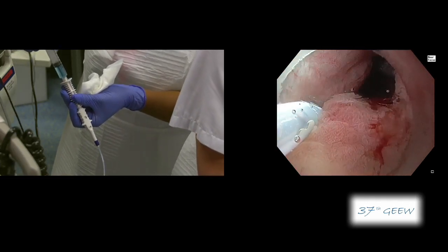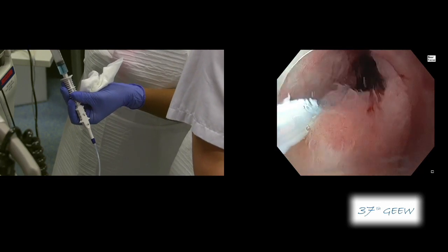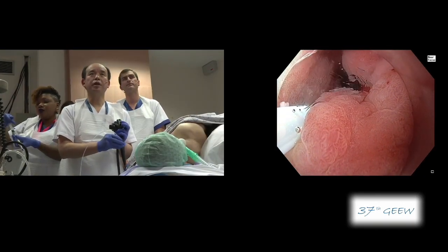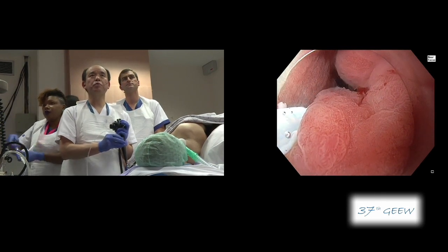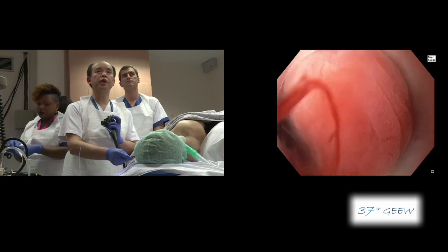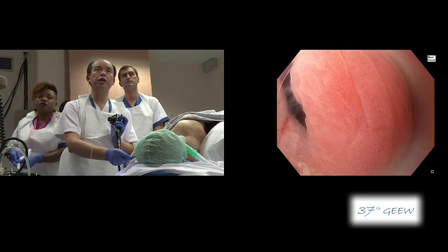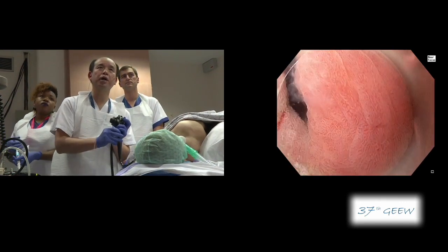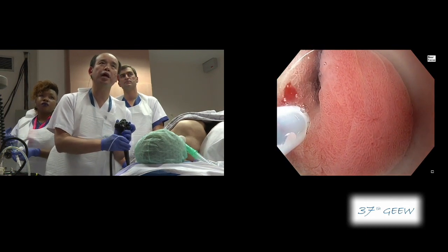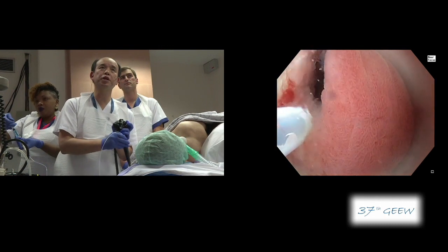This is really a difficult area to control. Therefore, it is necessary to cut the anal side first; otherwise it becomes almost impossible to cut the anal side after making submucosal dissection from the oral side. Therefore, I am injecting solution only at the anal side, then I will start the mucosal incision here.